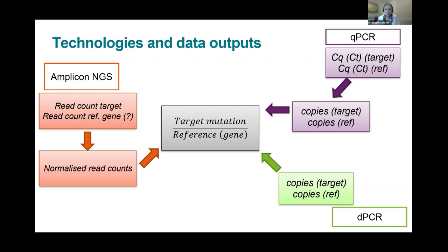But we also have more recent techniques such as digital PCR and targeted next generation sequencing, which are also being applied. So we have different techniques here, each of which will have their own sources of error, and it's important that those techniques give an equivalent answer for people who are being tested with those different approaches.